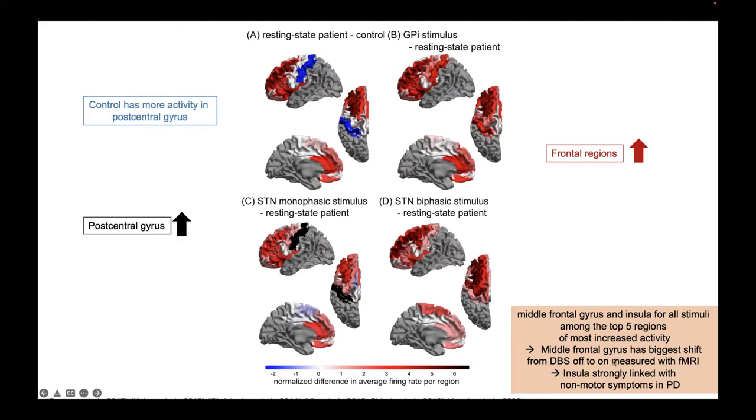All right, so what else can we see? There are lots of options. We can see all the frontal regions here being quite red, meaning that their activity is increased due to different forms of our stimulus in all of the three cases that we tried. And now you want to ask yourself, how is that actually relating to literature, right?